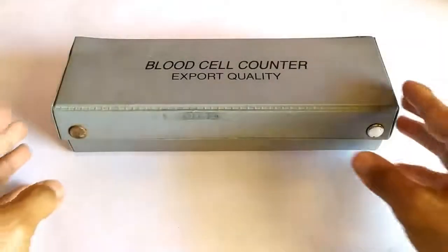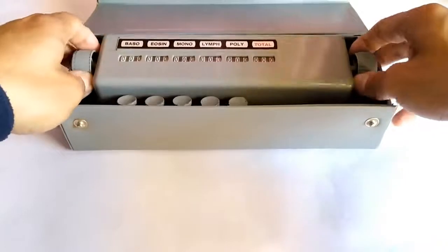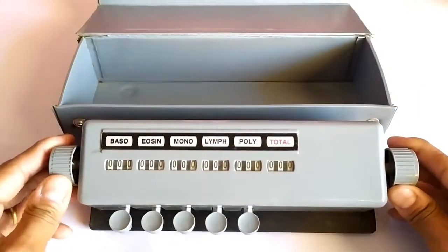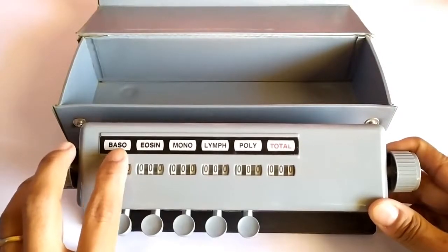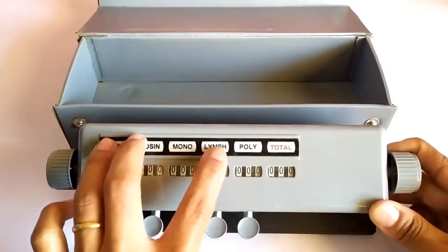Better still, you can make use of a handy piece of tool called the blood cell counter, which looks something like this. A typical cell counter contains 5 counting slots representing the 5 types of WBCs, along with one totaling slot that automatically adds up the numbers in the 5 slots into a total count.